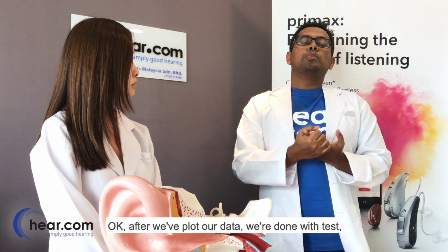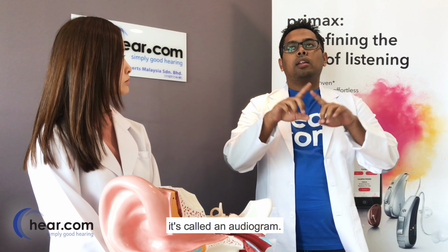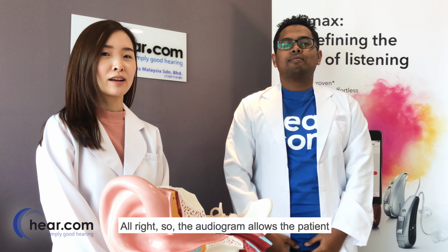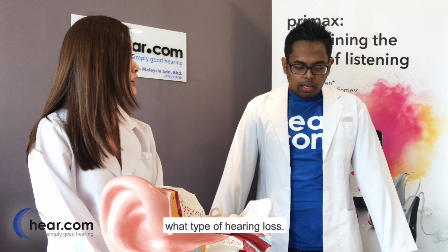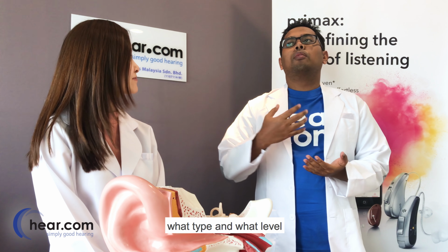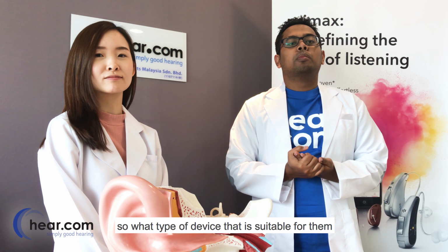After we are done with the test, we will plot the result on a graph. It's called an audiogram. The audiogram allows the patient and the family members to have a clearer picture of their current hearing condition, what type of hearing loss. Basically, from the audiogram, the patient can know what type and what level of hearing problem they have, and then we can also know what type of device is suitable for them.